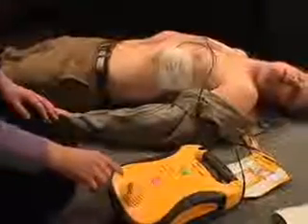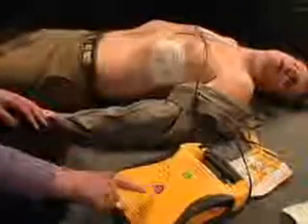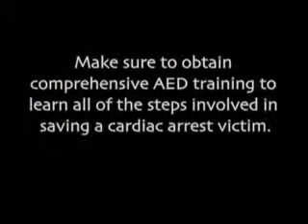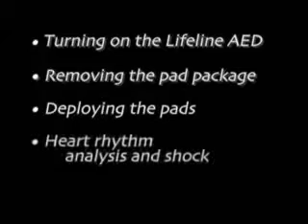Analyzing heart rhythm. Do not touch the patient. Shock advised. Charging. Stand clear. Press flashing shock button. Shock 1 delivered. It is safe to touch the patient. Begin CPR now. Make sure to obtain comprehensive AED training to learn all of the steps involved in saving a cardiac arrest victim. Let's review the basic steps involved in actually using the Lifeline AED.